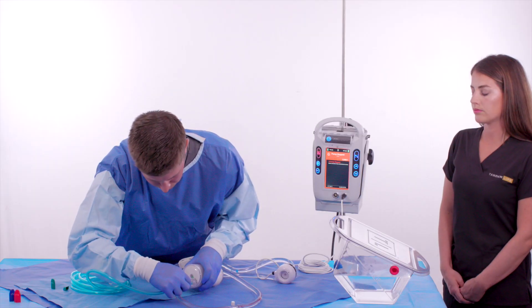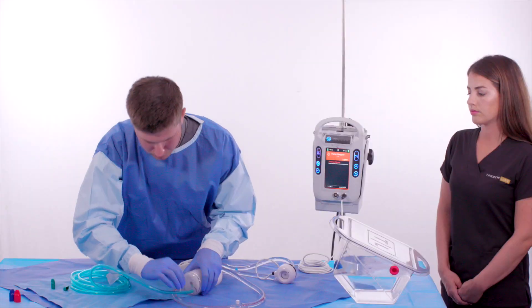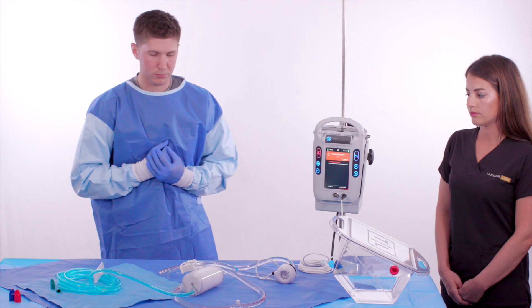The circuit is now ready for wet-to-wet connections to the inflow and outflow cannulae.